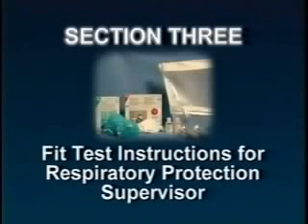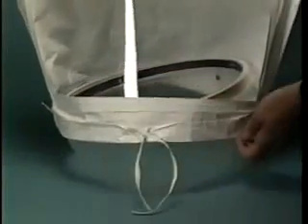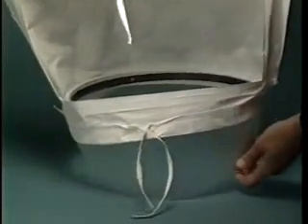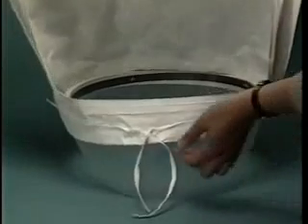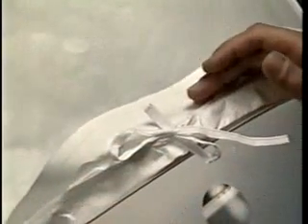The 3M qualitative fit test training meets OSHA qualitative fit testing requirements. To prepare for this qualitative fit test, attach the hood to the collar by placing the drawstring between the flanges on the collar. Tighten the drawstrings and tie it with a square knot or a bow.